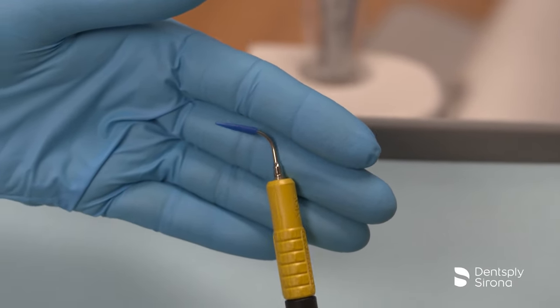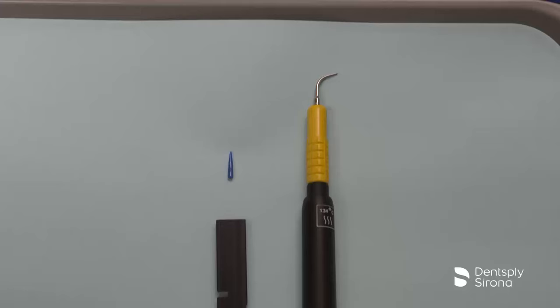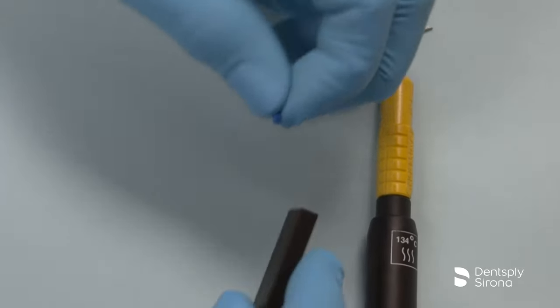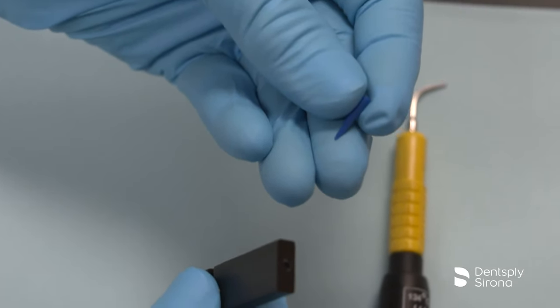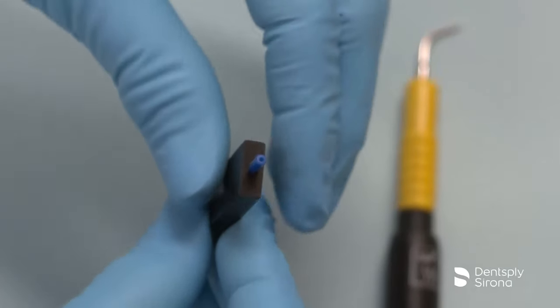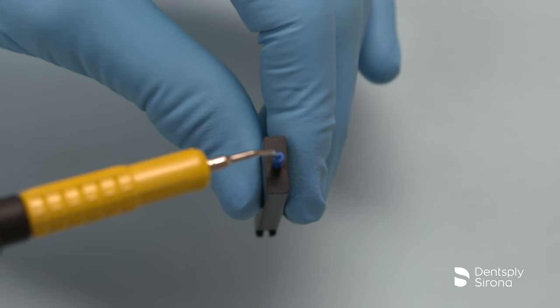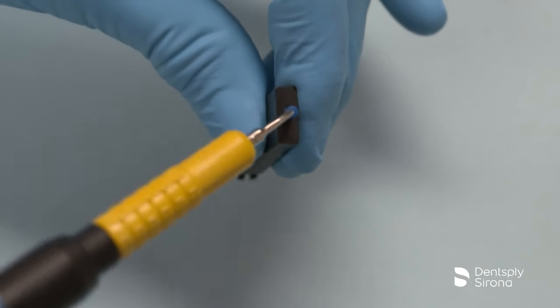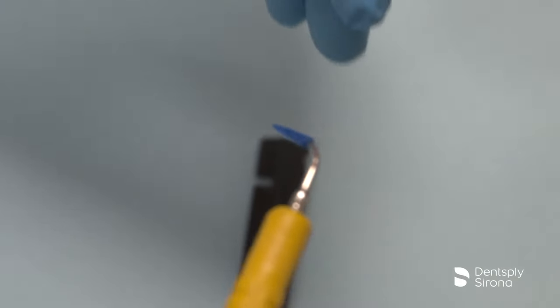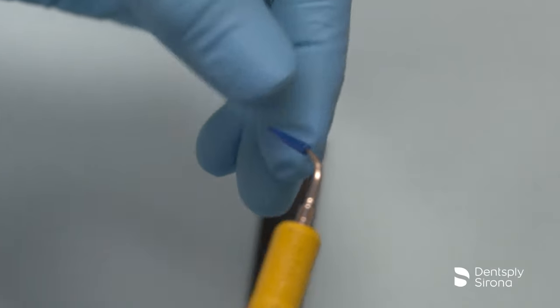The Cavitron Soft Tip Ultrasonic Implant Insert should never be used without the Soft Tip Disposable Profi-Tip. To prepare it for use, take a new plastic Soft Tip Disposable Profi-Tip and place it point first into the hole in the end of the wrench. Insert the metal tip of the insert into the opening of the Profi-Tip and twist one quarter turn while applying firm pressure to securely seat the disposable Profi-Tip. Disengage the Profi-Tip from the wrench and gently pull on it to verify it is securely in place.